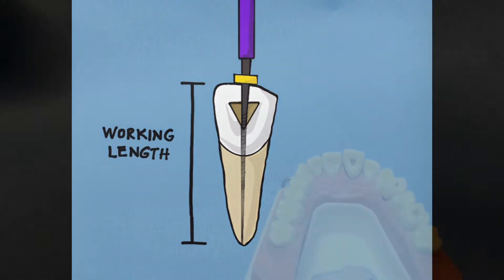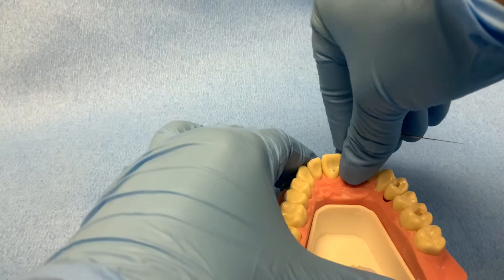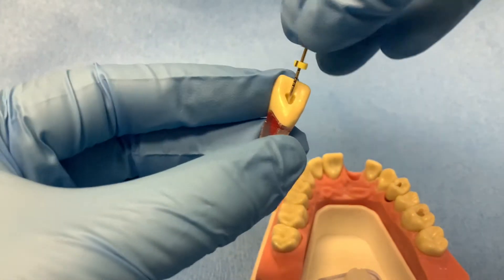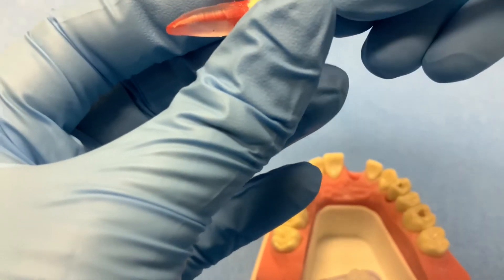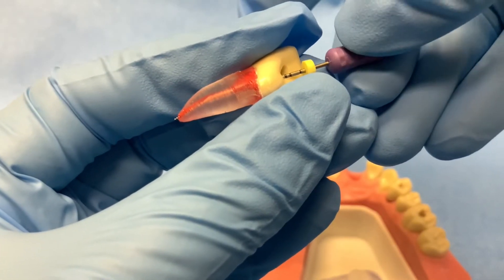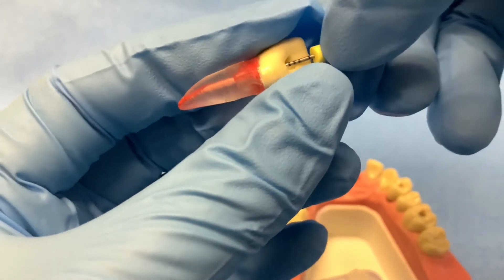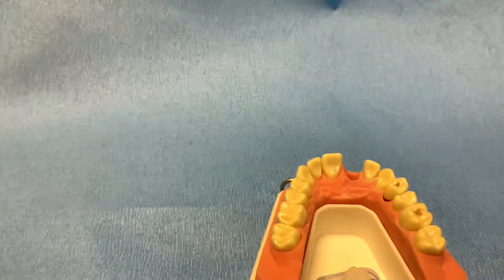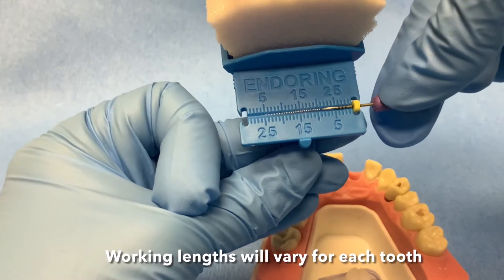In this preclinical exercise, the working length can be determined quite easily since the tooth is not attached to the typodont. Using a size 10 k-file, slowly explore the canal with a twisting motion — quarter turn in and pull — until it reaches the apex. Twist the file until it extends just past the apex, then twist back until it is completely within the root. Adjust the rubber stopper to the incisal edge of the tooth and measure this length using a ruler. This is the working length, and it should be approximately 25 millimeters for this plastic tooth.